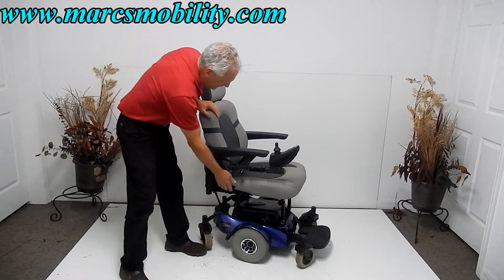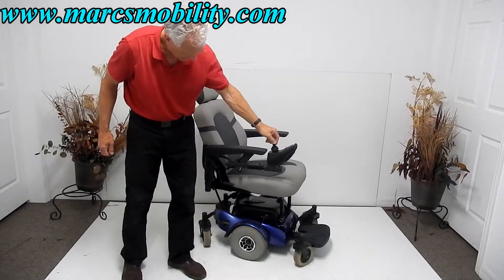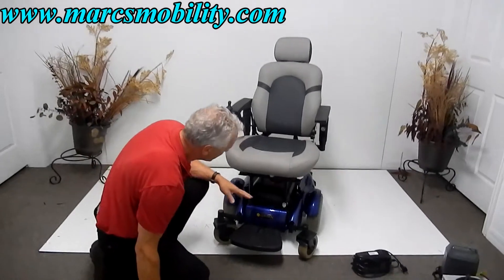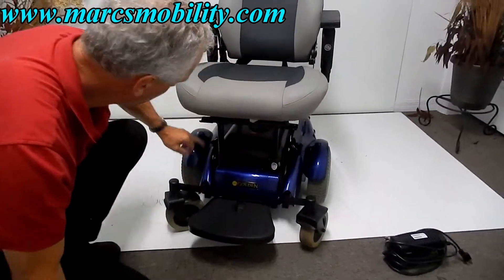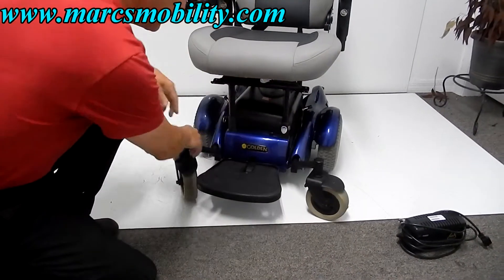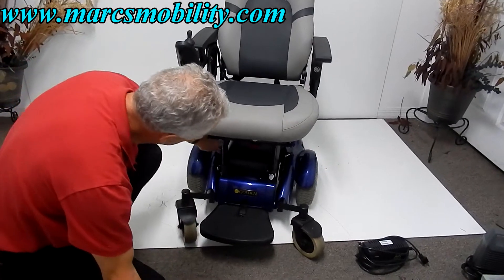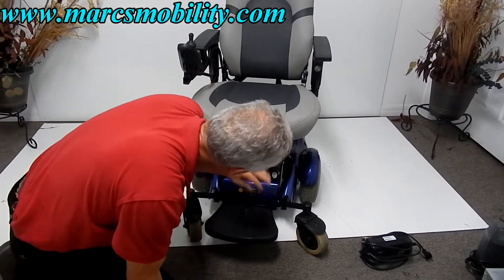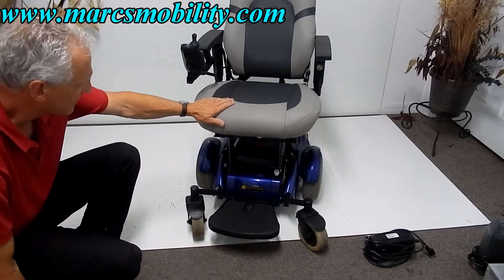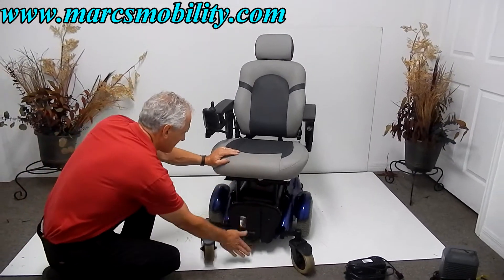The seat is adjustable back and forth. If you need to put this chair in neutral, you've got two levers — one here and one here. By turning the levers outward, the chair is in neutral and you can push it around with two fingers. Push the levers back in and you're back in drive.